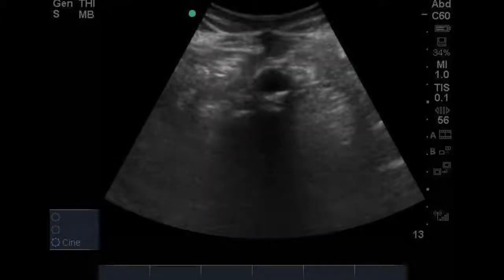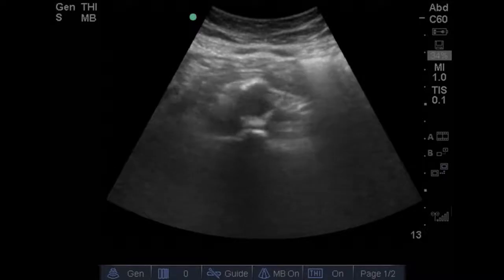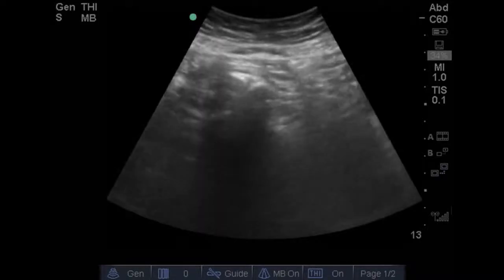What may be easier is identifying the abdominal aorta where there is no SMA or branches present, such as here, and we can measure the outer wall to gain an abdominal aortic measurement. You can see some air artifact, and this is likely very close or overlying part of the umbilicus. The other thing you can do, and much easier to identify the distal portion of the distal aorta, is you scan until you see the aorta bifurcate to the iliac vessels.